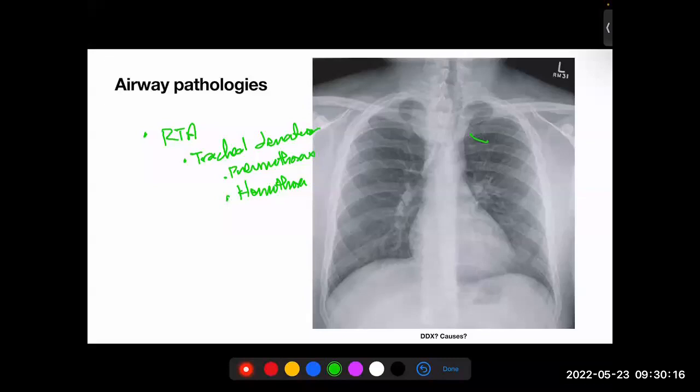I totally agree with you. But why? Because in lung fibrosis, the lung gets smaller. And when the lung gets smaller, because it's fibrous, a vacuum is created, and the body doesn't like a vacuum. So the mediastinum is pushed to that side to cover.